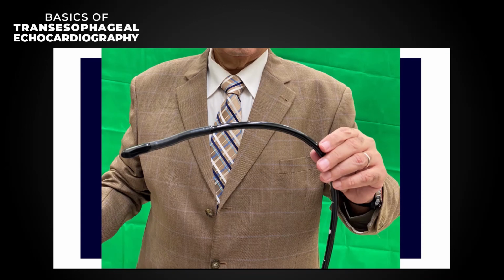Also, patients with cirrhotic livers or schistosomal hepatic fibrosis may have a history of esophageal varices. Be careful, because you might harm one of these varices, and the patient might suffer fatal esophageal bleeding.